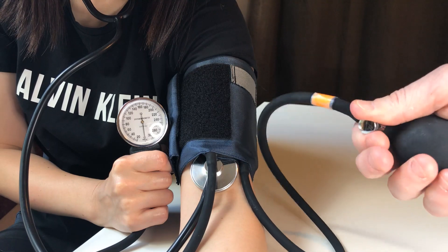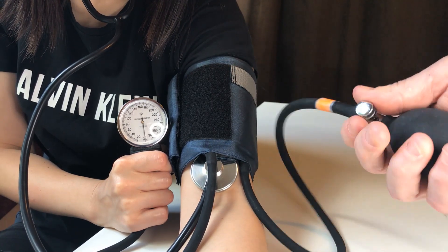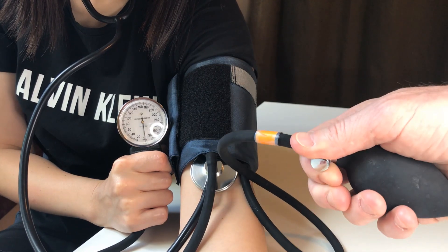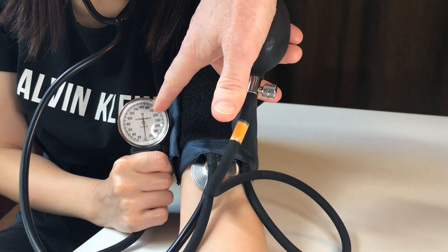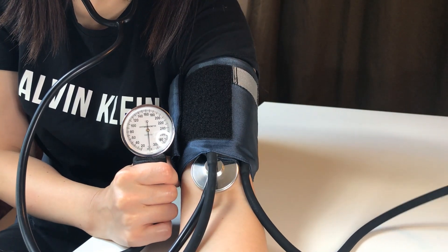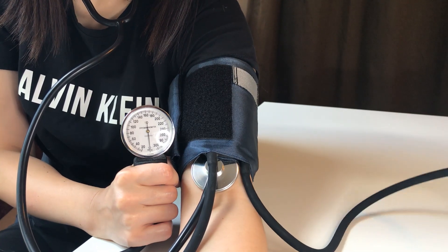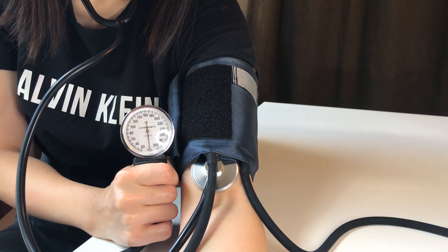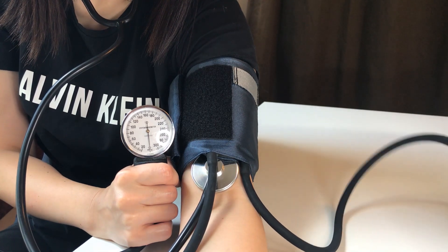When you tighten the valve, it's going to allow you to pressurize that cuff, and when you loosen it a little bit — lefty loosey — it's going to let some air out. I'm going to pump this dial up to about 160 millimeters of mercury. That's the unit of measurement here; there's no mercury in this, it's just a calibrated mechanical version of it.